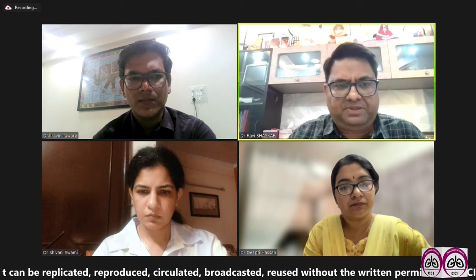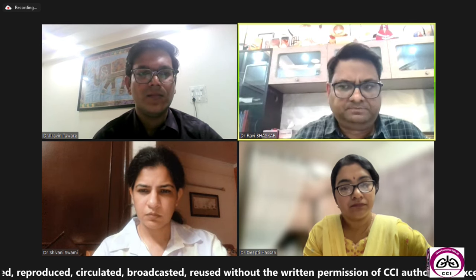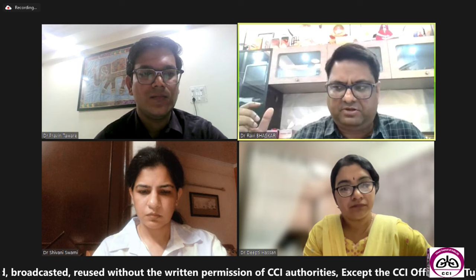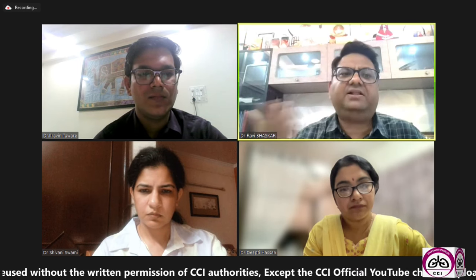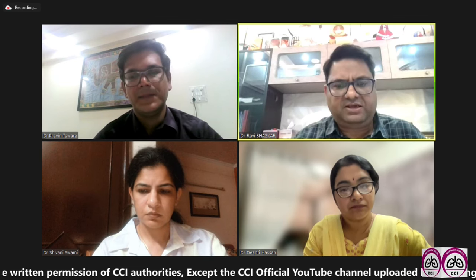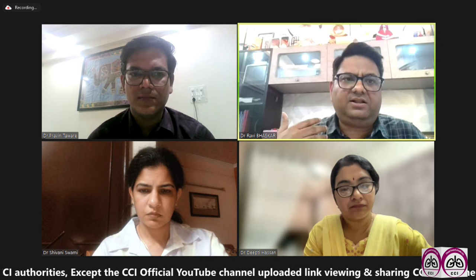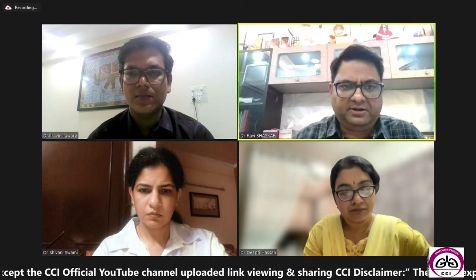And then, as Deepti madam told in her slide, there is the cold freon effect. Because of the cold freon effect, when the drug is released from the nozzle, it is around minus 30 degrees. And when it hits our throat, it's around 0 degrees. And with such a force of 110 to 140 kilometers per hour at 0 degree temperature, when it hits our throat, the muscle gets a spasm and the patient starts coughing.